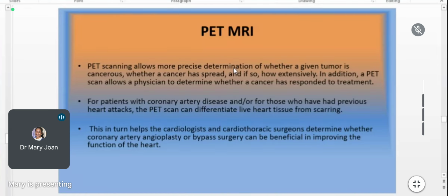If something is active, it will be seen as a hot or dark or black spot. And if something is non-functional or there is reduction in the blood supply or something of that sort, then it will be seen as cold or non-active areas. So this is kind of completely functional information, PET. And MRI gives the anatomical information, in the sense the contrast and resolution between similar types of soft tissues also.